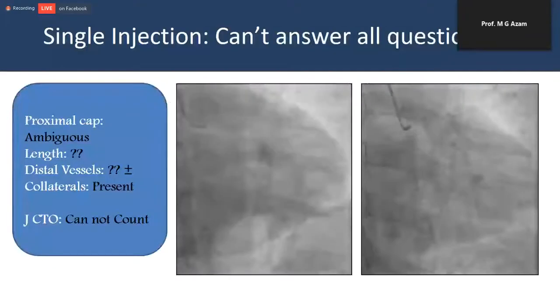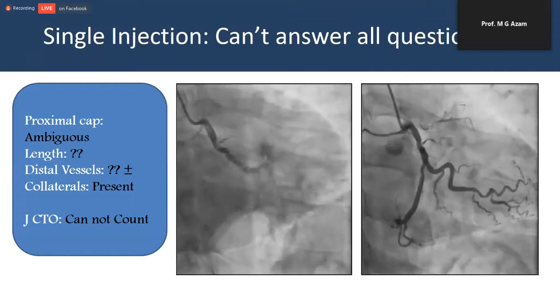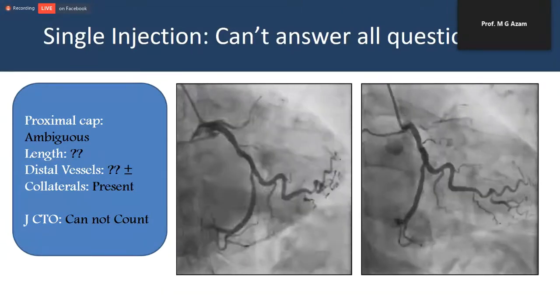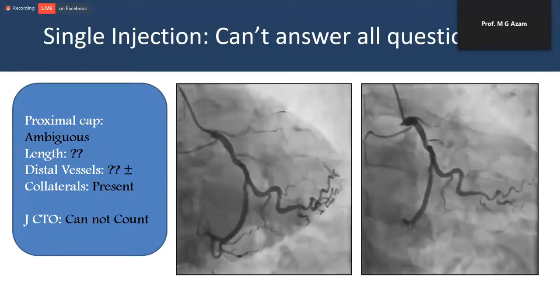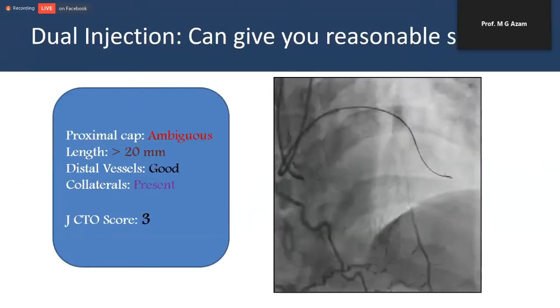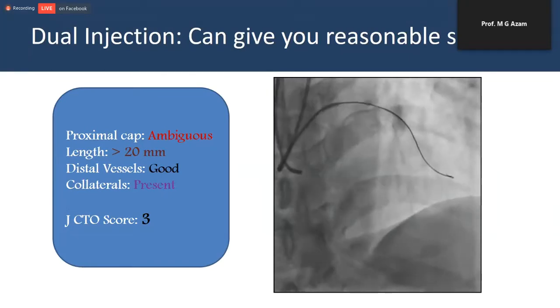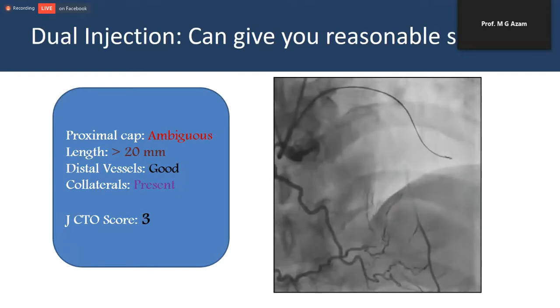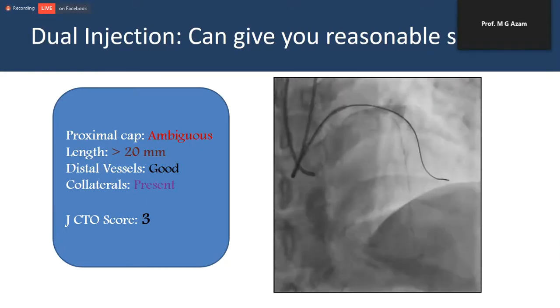So you see, if you give a single injection, you can't answer all questions like proximal cap length, distal vessel quality, and whether collaterals are present or not, and overall you can't assess the JCTO score. Dual injection can give a reasonable solution, so you can assess the proximal cap ambiguity, length of the lesion, and distal vessel quality, and you can comment on whether the collaterals are good or not. Finally, you can assess the J-CTO score or the PROGRESS CTO score. You can assess, then you go for that.